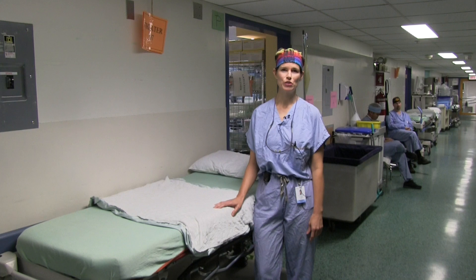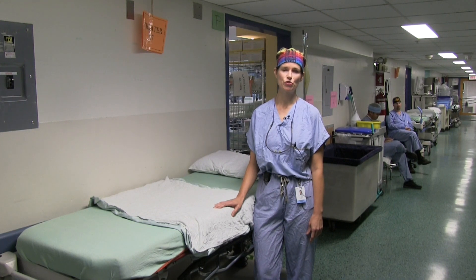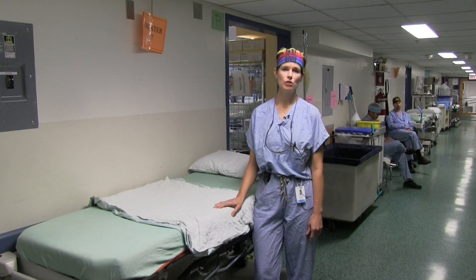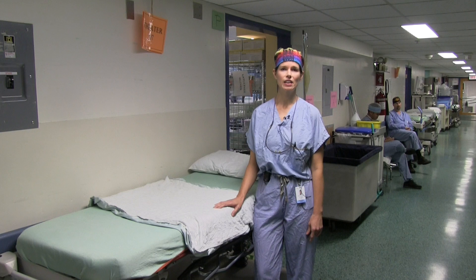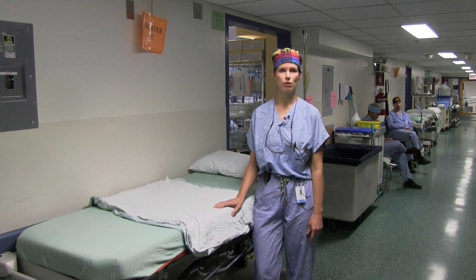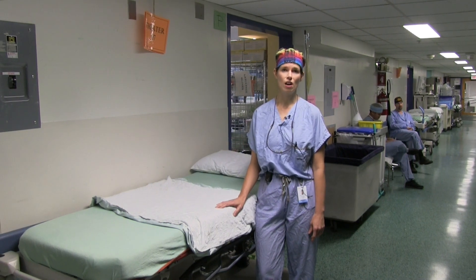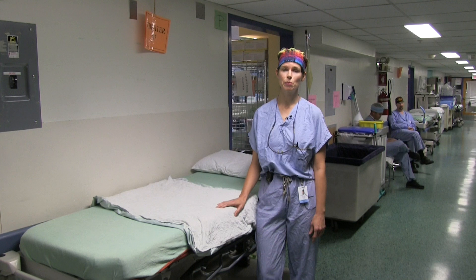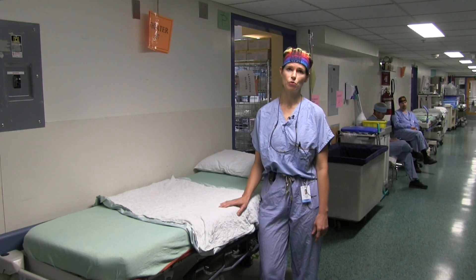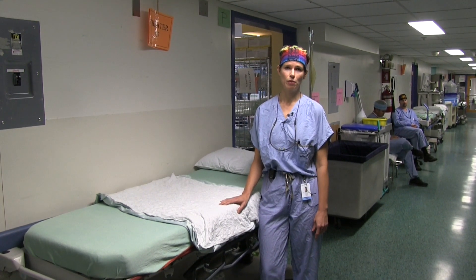Hi, I'm Dr. Shannon Fraser, Chief of the Division of General Surgery at the Jewish General Hospital. You're about to watch the correct technique for patient transfer in the operating room. You might think this should be obvious, but unfortunately patients and OR personnel have been injured when this has been done without enough help.